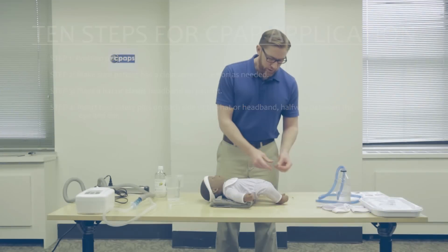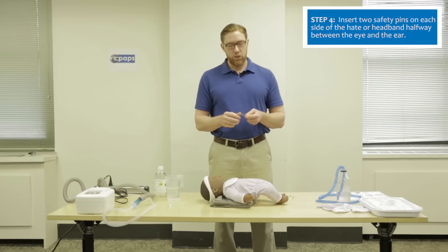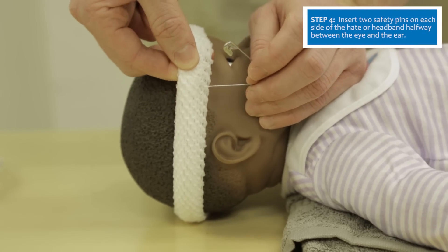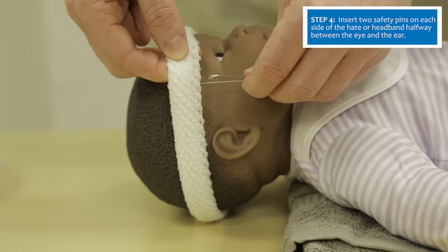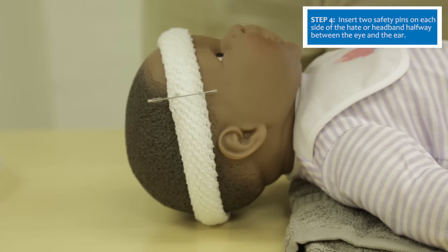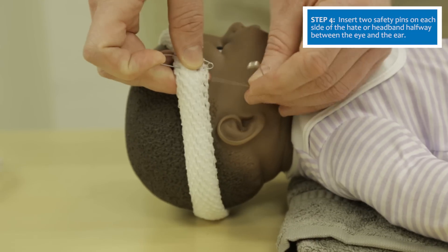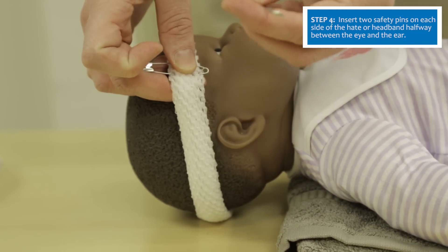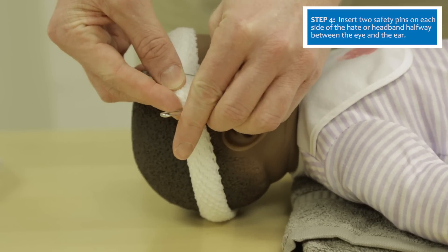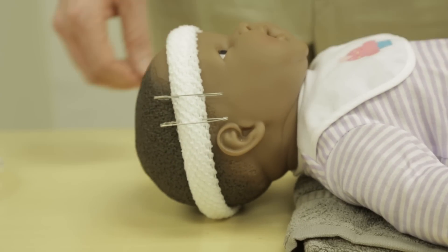Place two safety pins on each side of the patient's head. The safest position is halfway between the eye and the ear. Insert one or two fingers between the patient's skin and the bandage to ensure you don't stick the patient. The first safety pin goes just lateral to the patient's eye, and the second with approximately one finger width from the first. Ensure the sharp point of the safety pin points up and away from the face.